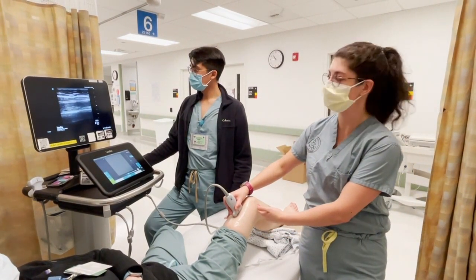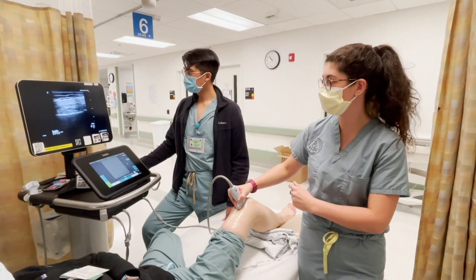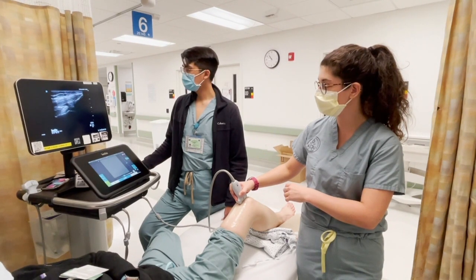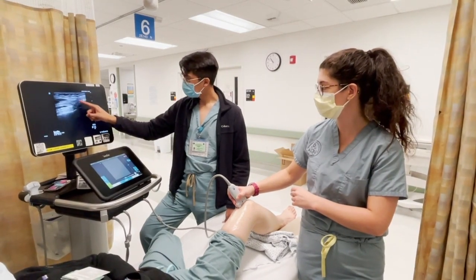As we slide down, we can see how the quadriceps muscles come together into a big hyperechoic band that will insert right on the top of the patella. In this location directly superior to the knee, we can see the two fat pads: the pre-femoral fat pad as well as the quadriceps fat pad. Major structures in the suprapatellar space to recognize are the quadriceps tendon, the patella, the femur — which exhibit a hyperechoic line with shadowing deep to it — and then the fat pads, which are hyperechoic but more globular.